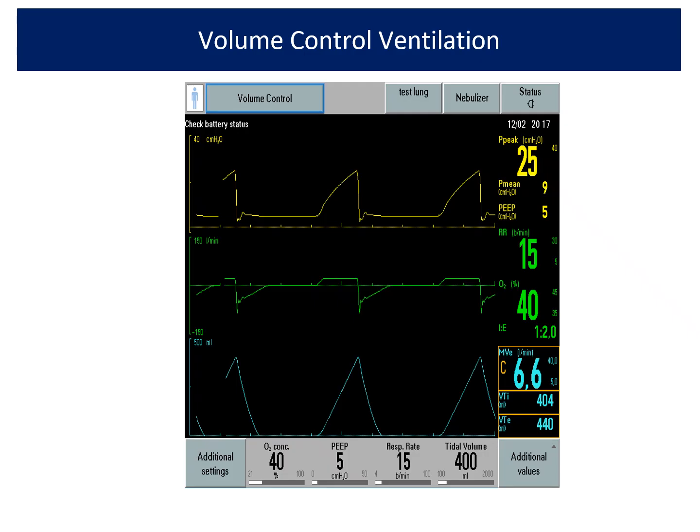When the patient is very deeply sedated, it is more like a reflex of the diaphragm. So once the patient is very deeply sedated and you give a volume through the ventilator, it will lead to contraction of the diaphragm, and that can sometimes lead to severe asynchrony, but that's called reverse asynchrony. There is no way you can just see the curves and differentiate between cycling asynchrony and reverse asynchrony unless you have an esophageal pressure monitor where you can actually see the diaphragmatic contraction, right?